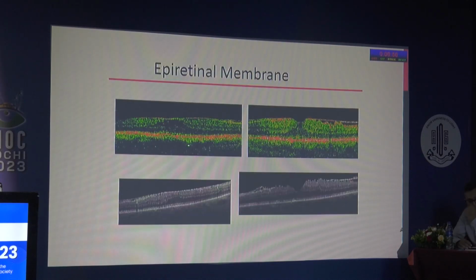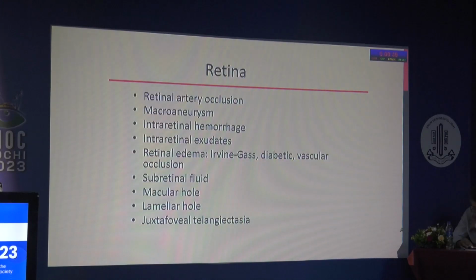So see, there is a change in the retinal texture, but again you have to correlate with the vision. Sometimes OCT, like MRI, shows more than what actually needs to be done. I am just making the routine lineup for the diseases. Important areas will be retinal edema. Again here OCT has come in handy for us.